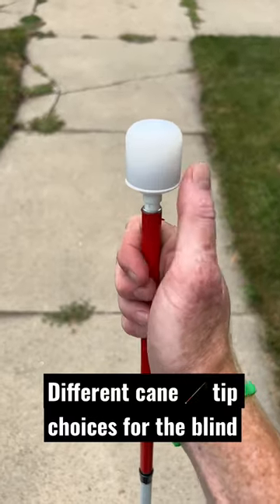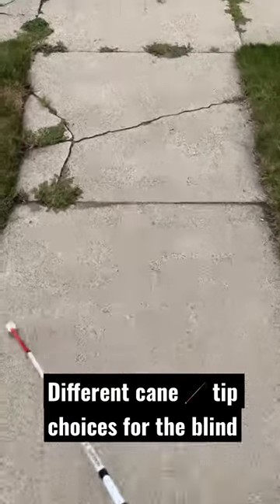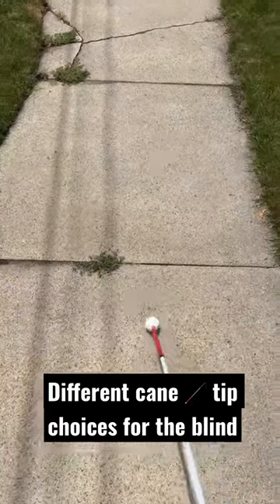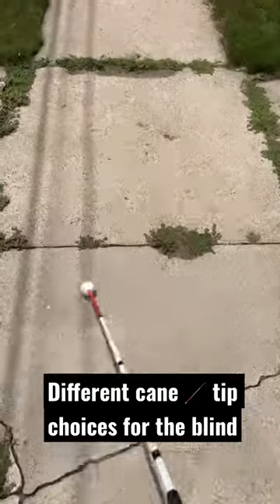Here we have a marshmallow rolling cane tip, and this one is also a cane tip that rolls left to right, side to side. And finally, here is a rollerball cane tip which does a pretty good job of just rolling left and right and going over a lot of cracks in the sidewalk.